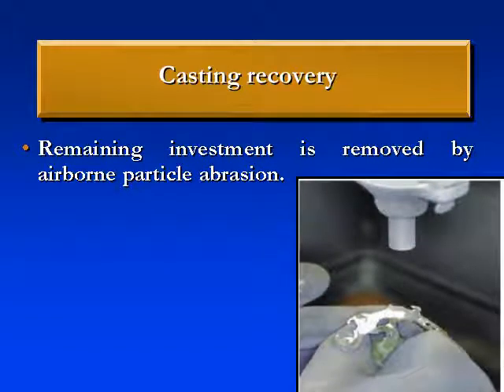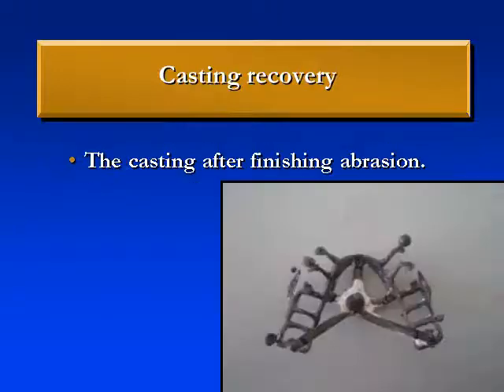In this figure we saw the remaining investment removed by airborne particle abrasion. The casting here, after finishing the abrasion, is ready for the other steps of the manufacturing.